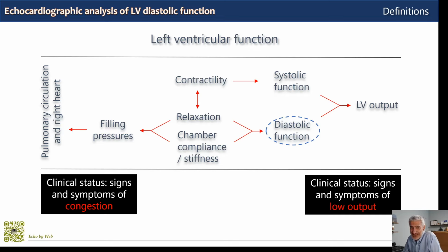Finally, modern diastology cannot ignore atrial systolic and atrial diastolic function, which must always be described and taken into consideration. But this is a topic of a separate video, a quite complicated topic. If we fail to provide all this information, we will not provide an adequate, non-invasive hemodynamic assessment with our echocardiographic examination, and we will not exploit the full potential of modern echocardiography.